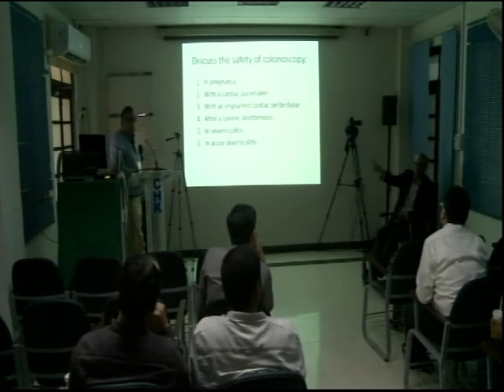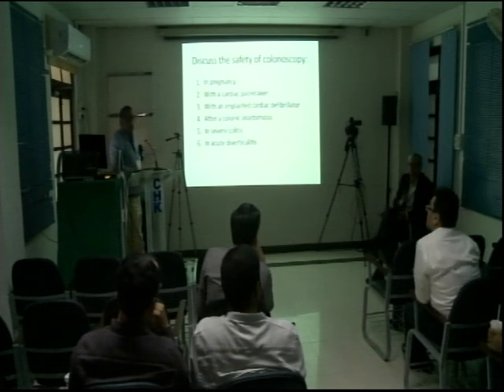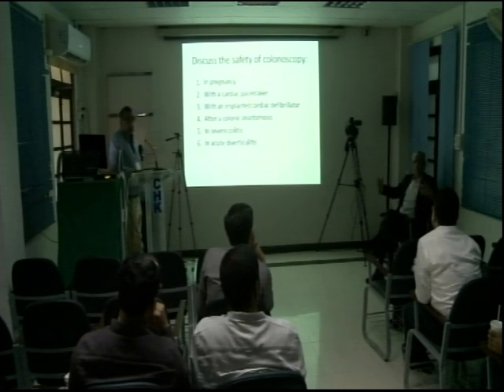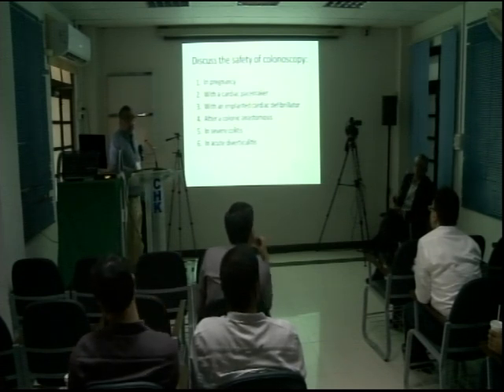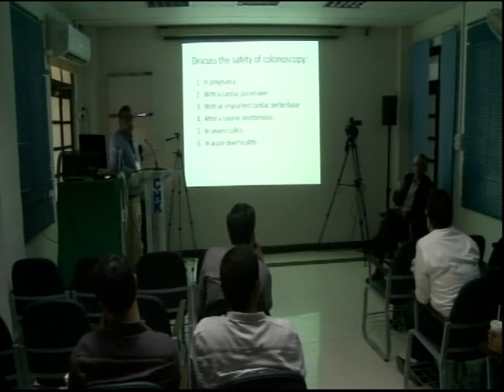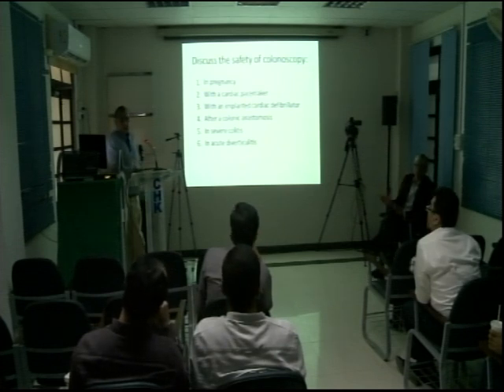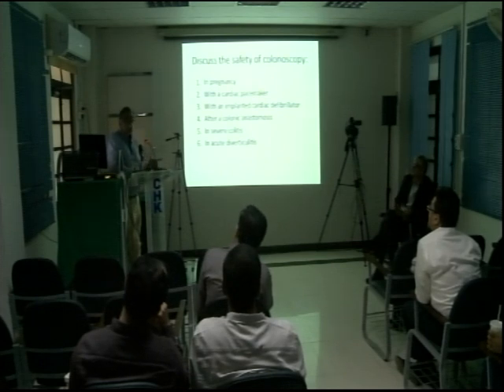So you go in, but like he said, you try not to insufflate, especially if it's obstruction, because your air is going to make the proximal section even more dilated and the patient will balloon up. When you're doing it in an obstructed person, you try not to put your finger on the air. You're just trying to do colonoscopy without a proper view, which is possible. In distal volvulus you do therapeutic colonoscopy to decompress it, but that again has to be an experienced colonoscopist.